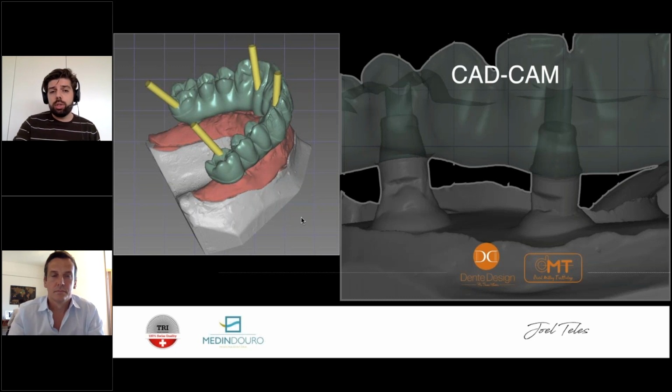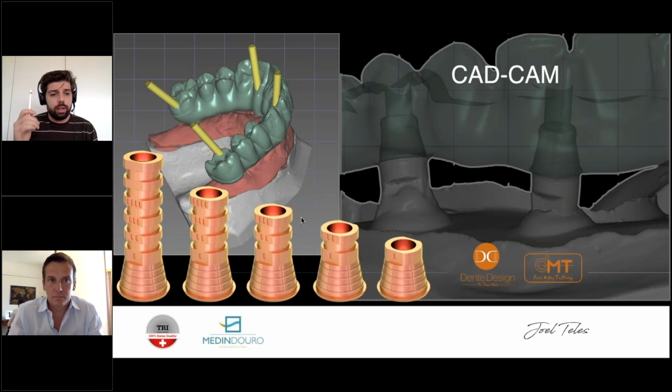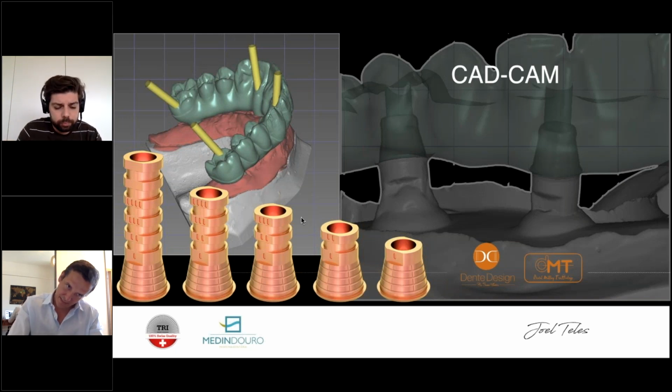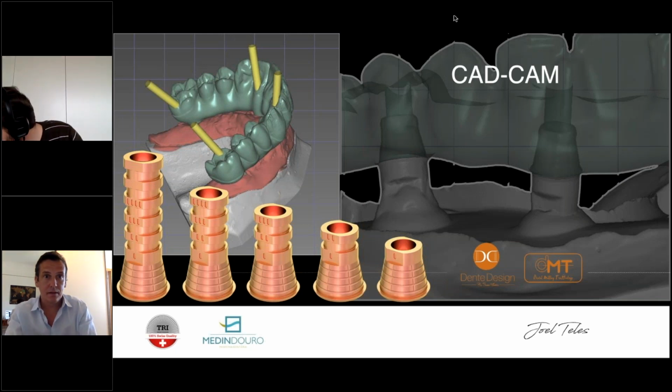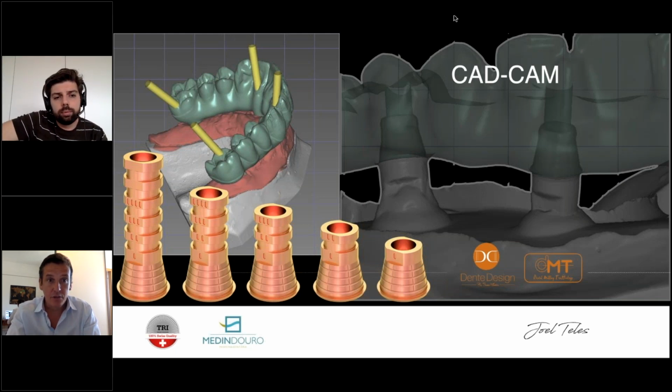And here you get to choose the height of your tie bases on the virtual library, using the drawings of the try-in that you just did. So all the alterations are now virtual again, and you get to choose the correct height in each position. Let me add two things prosthetic-wise. You see on the left side the height of the TTA abutment, which Joel used for the temporary restoration during the operation, so the immediate restoration. You can use it very long, and then you have these 5 different heights which you can choose also digitally.